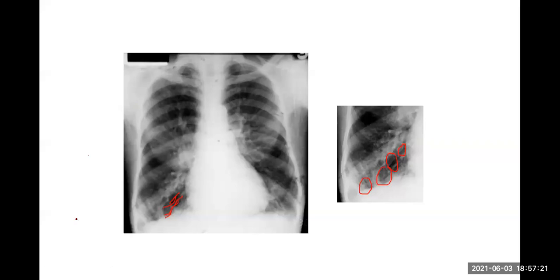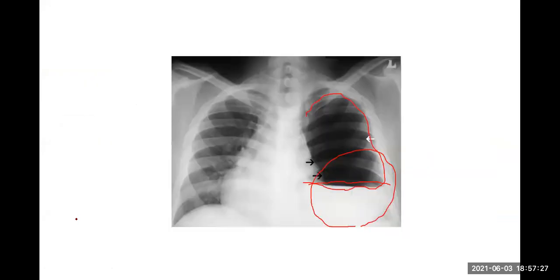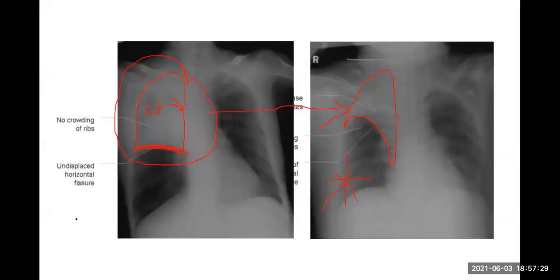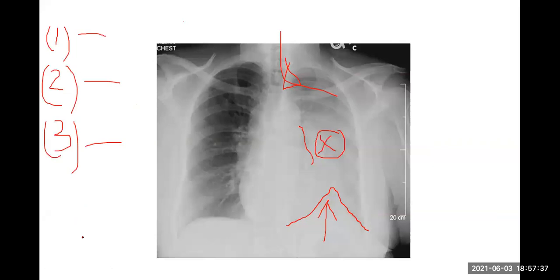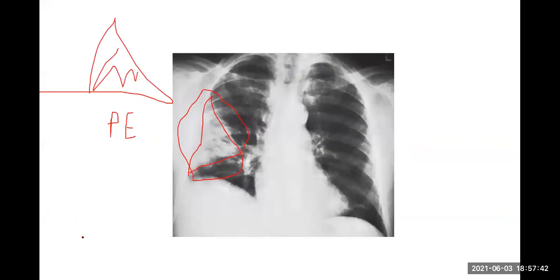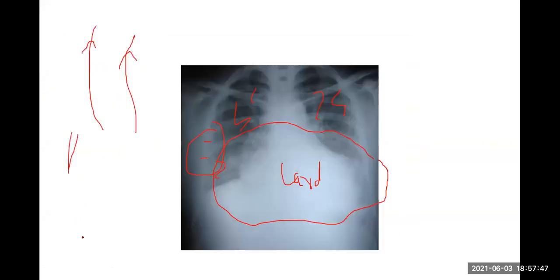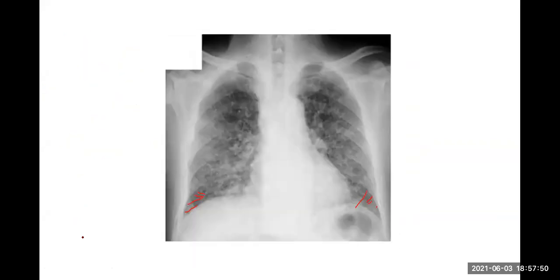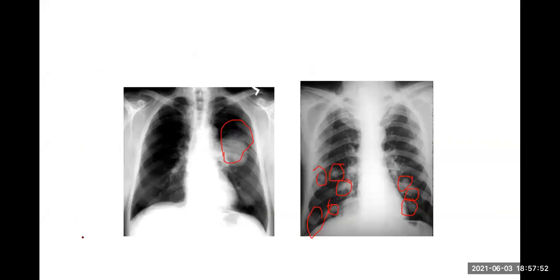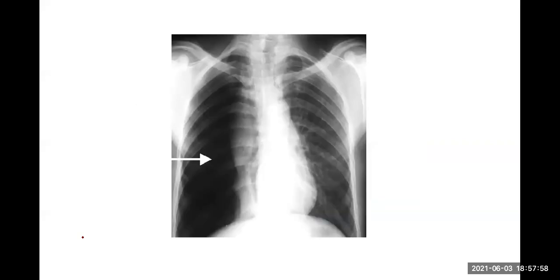Right. So these are all these white lesions. Pleural effusion, hydropneumothorax, consolidation, collapse. So I give you three differential diagnoses of this appearance, right? Then patchy white everywhere, I'll give you 5 differential diagnoses, right? Then nodules, small nodules, reticular nodules, in some cases, large nodules, multiple large nodules, and lung abscesses. And I've also shown you a picture of bronchiectasis.